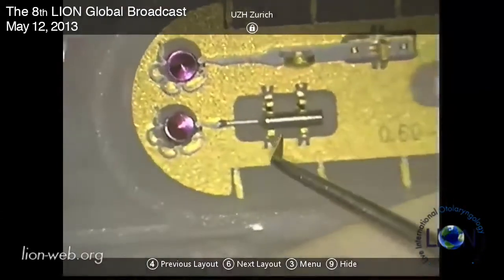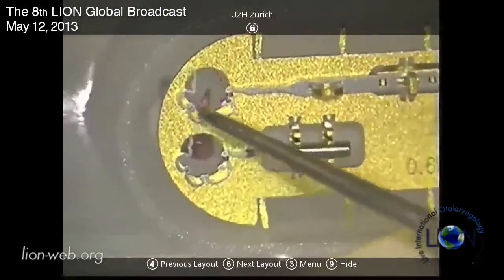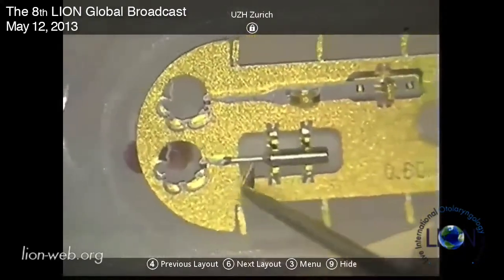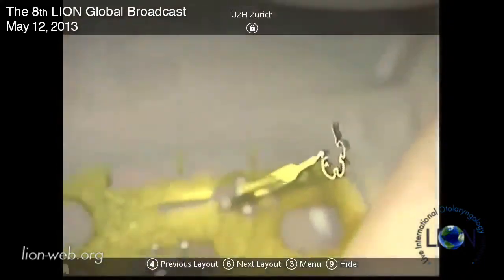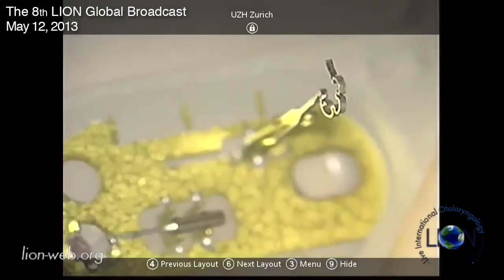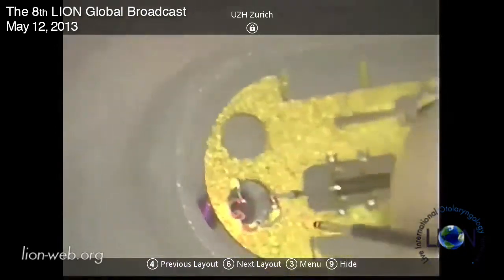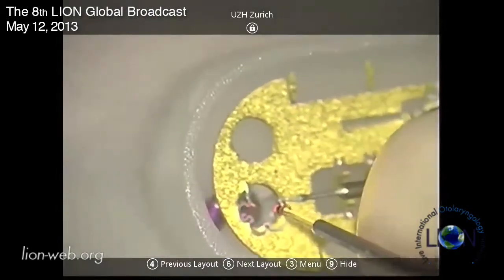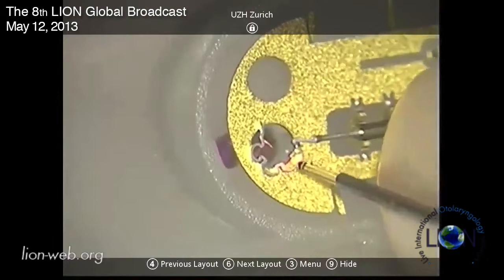This is the actual prosthesis here, it's made of pure titanium. These two stoppers actually prevent it from closing. There is a second prosthesis to calibrate your laser - I can show you how that works. I know I'm going to need 1.5mm but I can just show you how it actually works.